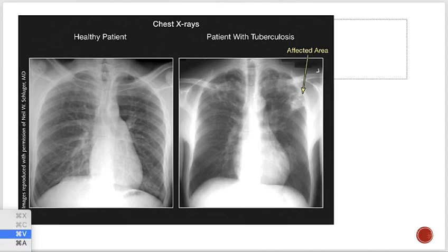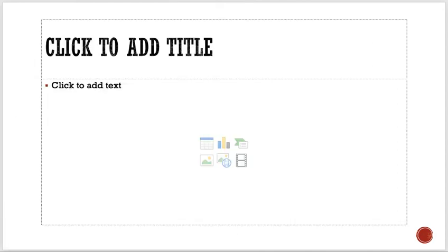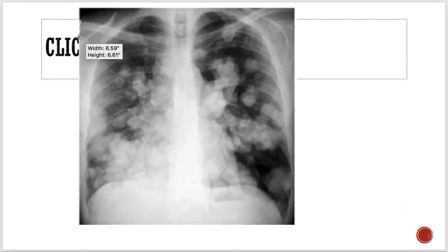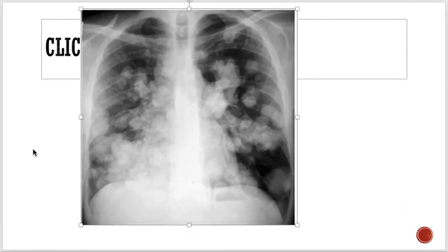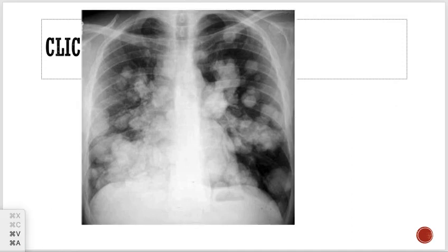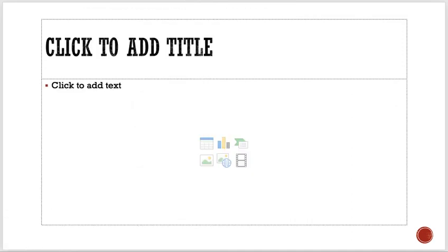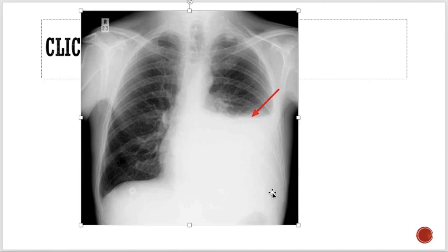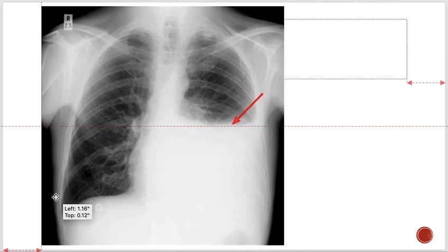One more X-ray I can include is this. See, the abnormalities in front of you, right? A lot of masses you can see, of course. Maybe this could be a tuberculosis patient. Or for example, I can show you one more X-ray. Now see, this one is completely abnormal. Normally we should see this costophrenic angle, but see, all of this thing is fluid. So this is an X-ray of a unilateral pleural effusion, right? You have done pleural effusion, so that's why I show you this one. Like this is an X-ray of unilateral pleural effusion.